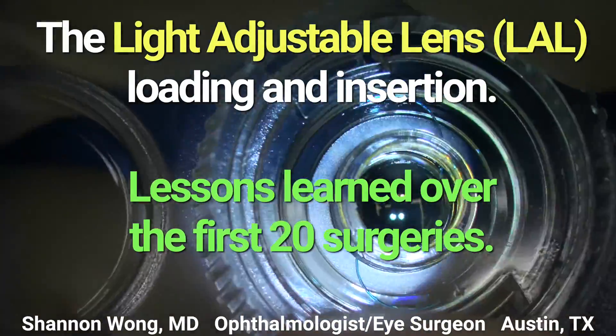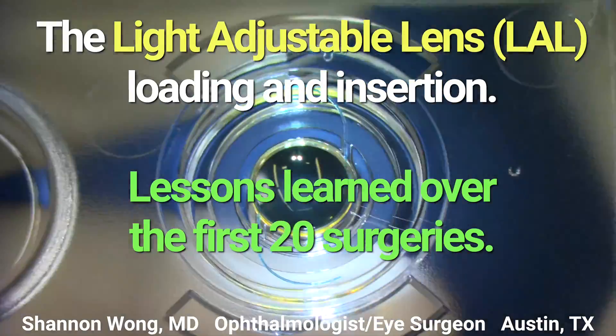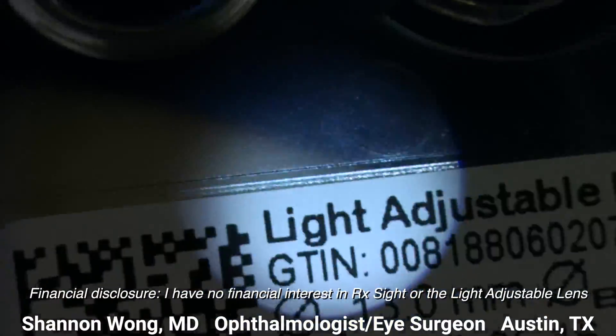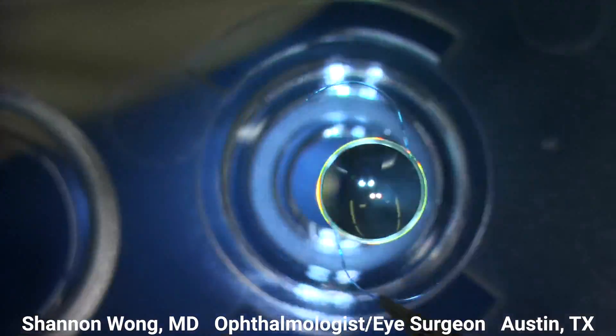The light adjustable lens insertion process is different from the insertion process for any other lens implant. In this video I'm going to share some teaching points from five different LAL insertions.